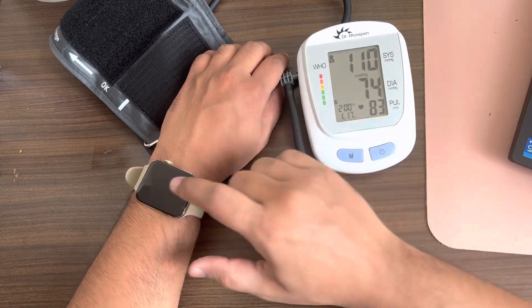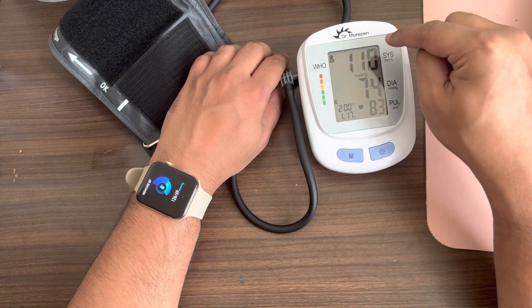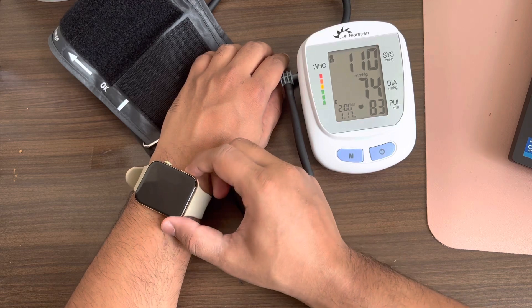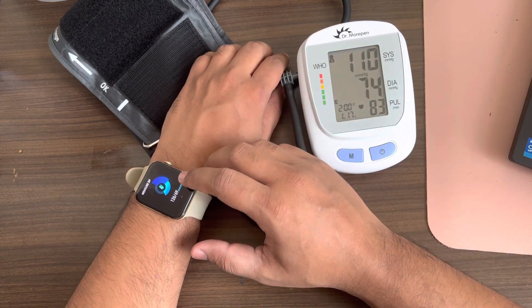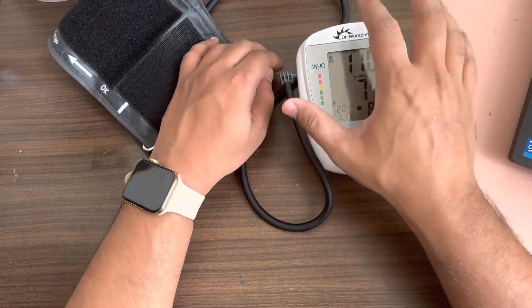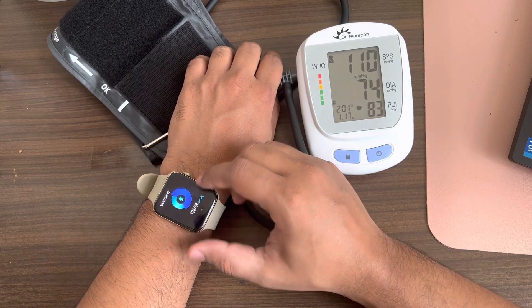Running them separately now: the smartwatch is showing systolic as 126, whereas the monitor came in at 110. Diastolic on the watch is 69, and on the monitor it is 74. So it is not very accurate compared to the dedicated BP monitor.